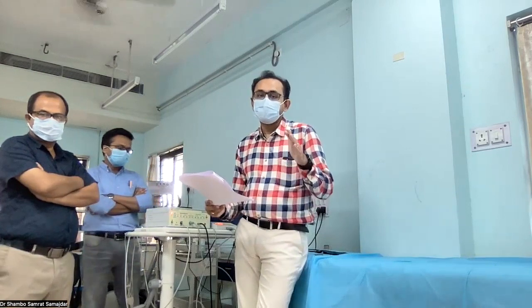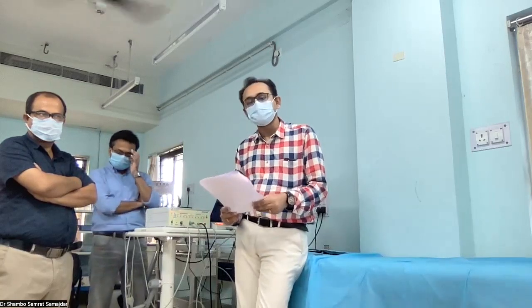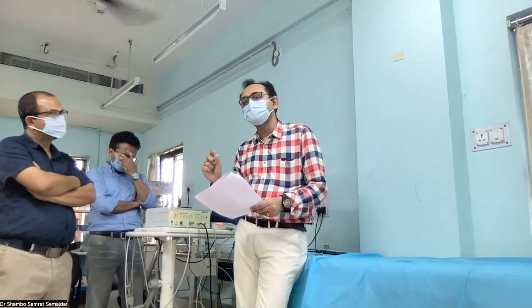And for that, we need to separate two groups of tests for cardiac autonomic neuropathy. The first group is to test parasympathetic nervous system dysfunction, and the second group is sympathetic nervous system dysfunction. For parasympathetic nervous system dysfunction, we generally have two tests. Number one, the Valsalva maneuver. How can we do this Valsalva maneuver?